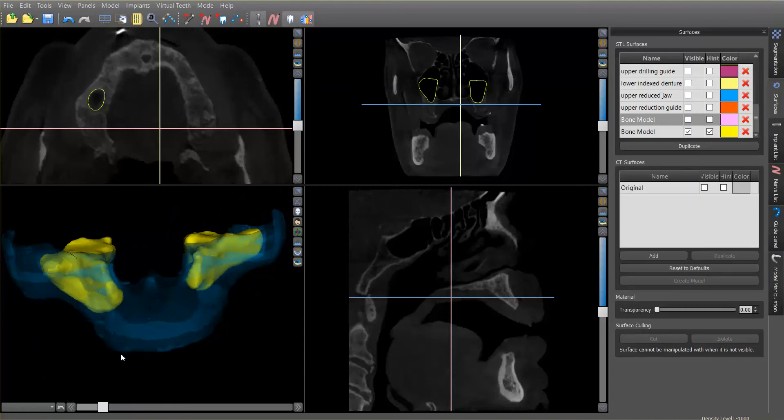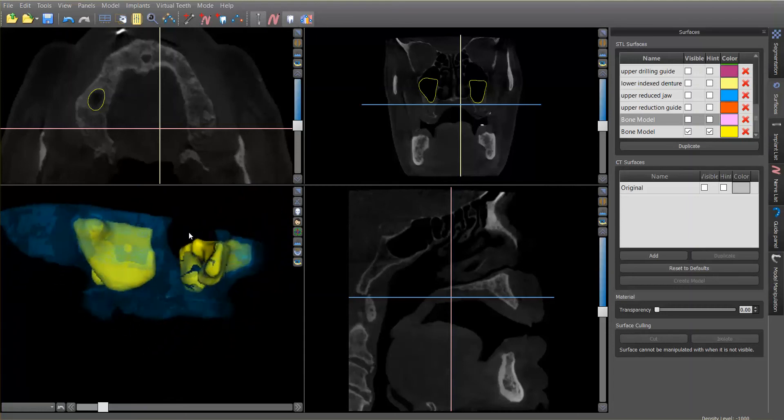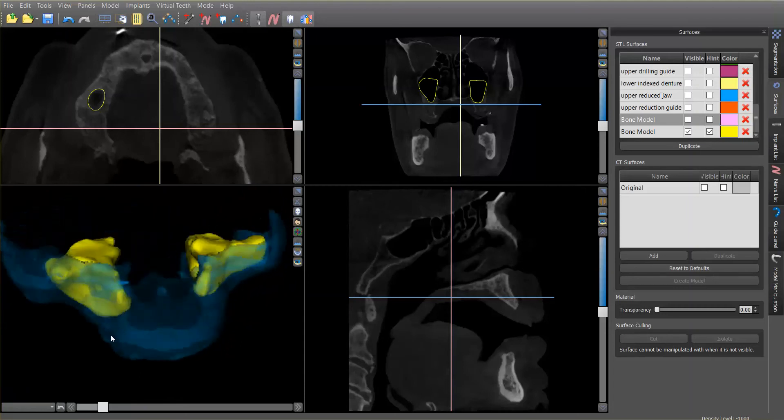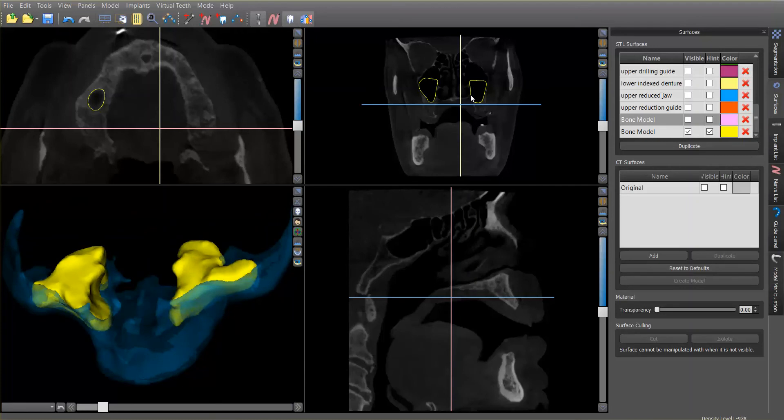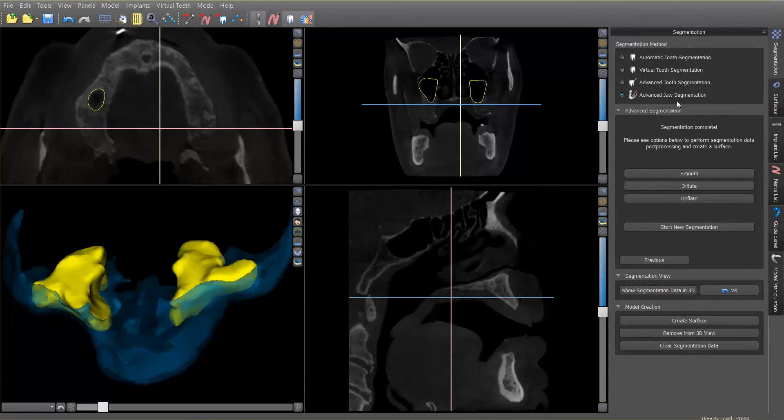So Armin had been talking to me about trying to get a way within Blue Sky Plan to be able to analyze the airway. And so I was playing with that, and the first thing I tried to do was just do the segmentation. But segmentation is meant to select objects of a particular density and higher, whereas when we're trying to analyze an airway, we're trying to select objects of a certain density and lower.